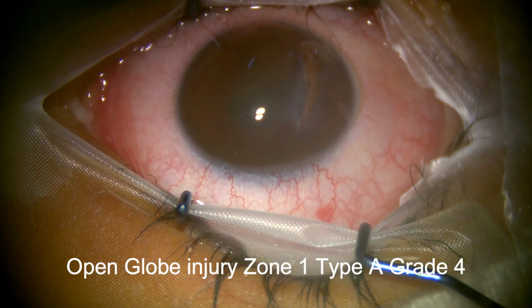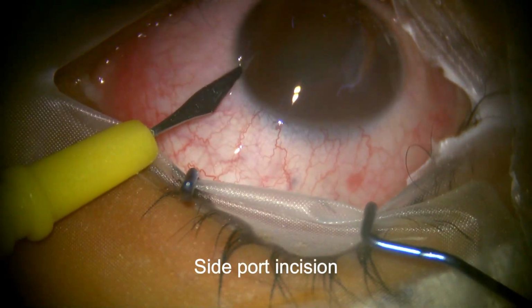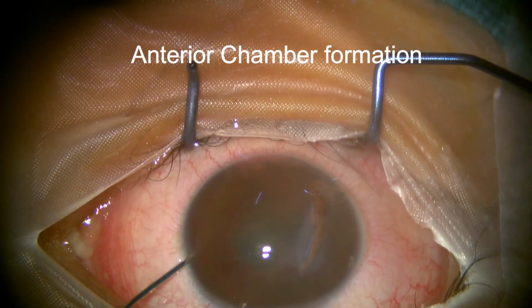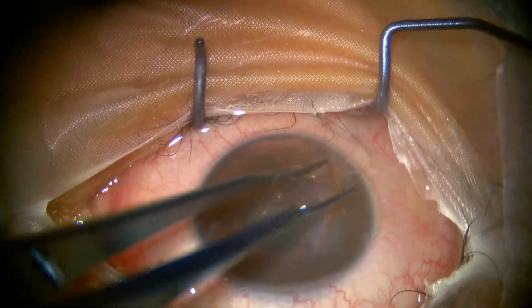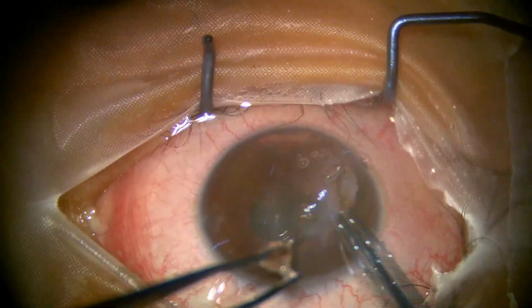This is the corneal laceration planned for the primary repair. Side port is being made using 15-degree lance blade at 2 o'clock position. AC is formed using viscoelastic. The area for primary repair of corneal suture is being prepared.